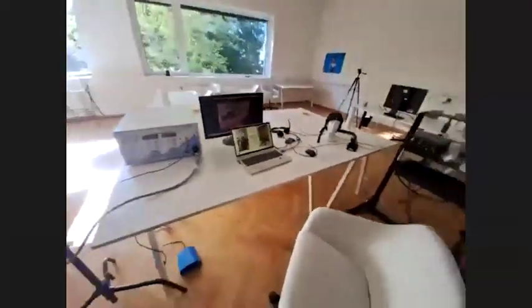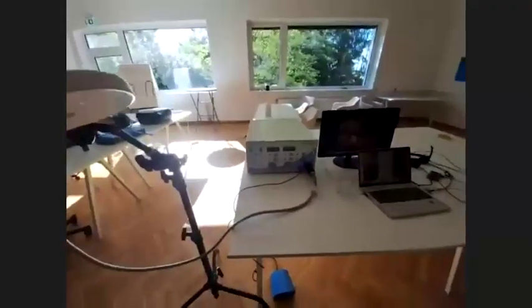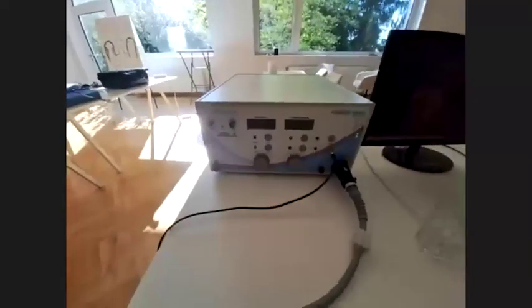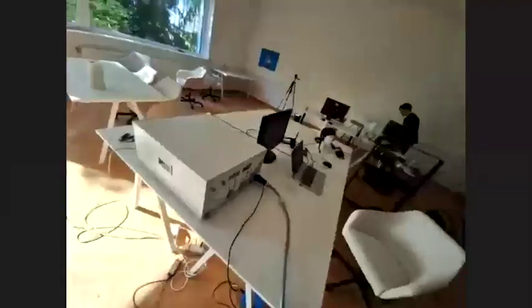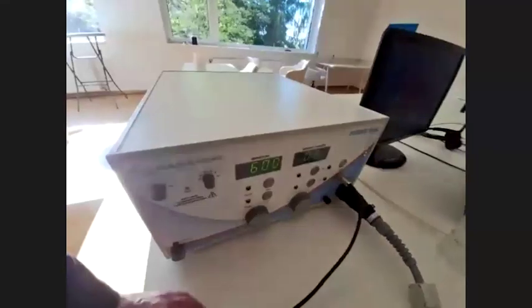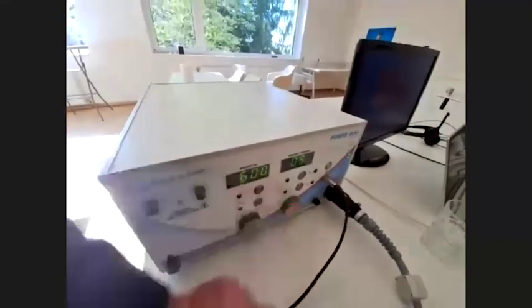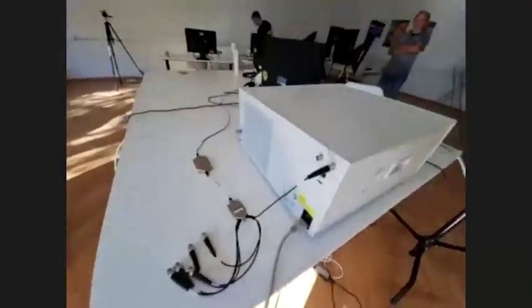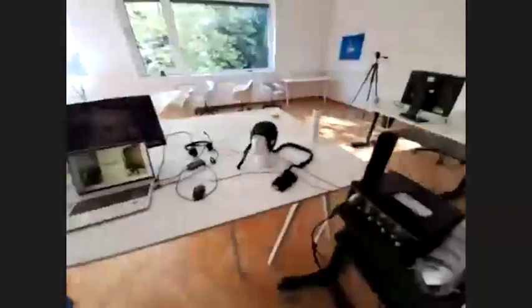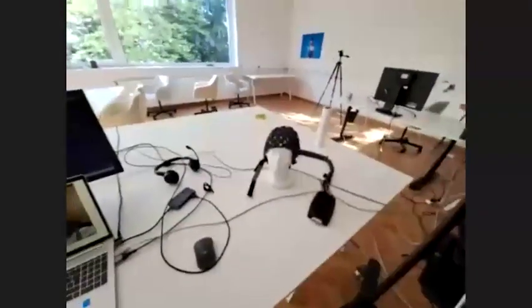So we have a setup here with a TMS device. Over here we set it up to 60% of the intensity. We can adjust for higher or lower intensity. We can also adjust the frequency of the pulse. Then we have the trigger output that is connected to our amplifier. So this is this green cable coming in. That's how we will trigger. And then we have our box and the cap there.